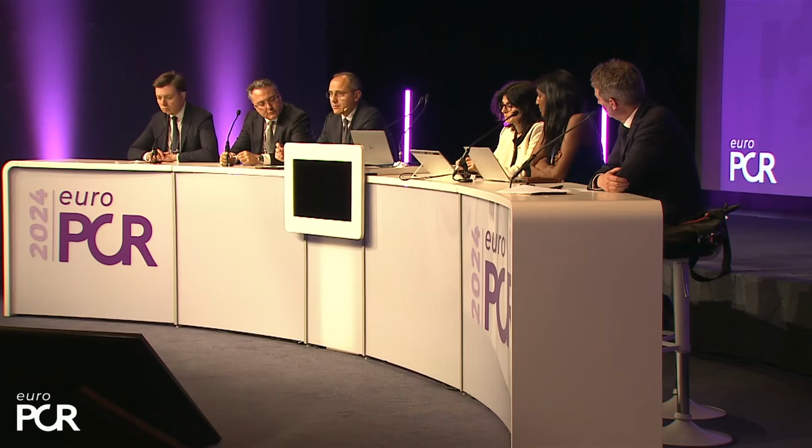Okay, just to recap the steps they went through, because again, in the editing, some messages could not easily come across. So they did further plaque modification with balloon dilatation. At a certain point, they decided to do IVL with a 2.5 millimeter balloon because they saw some degree of eccentricity, especially with balloon inflation. But Vani also mentioned this during the first lecture on IVUS, and they did an intermediate IVUS assessment, because we need to decide whether we are happy with the current extent of plaque modification or we need to do more, or can we stent.